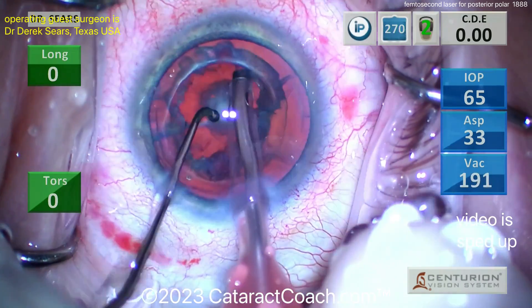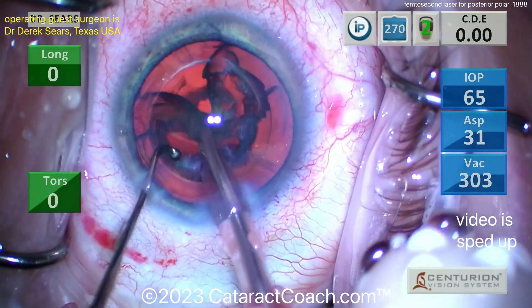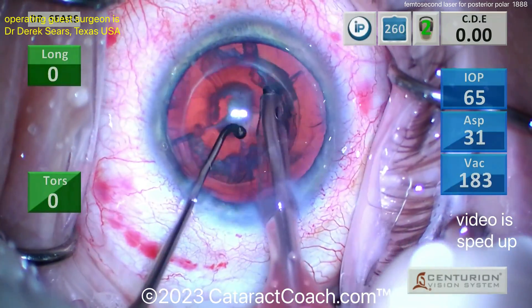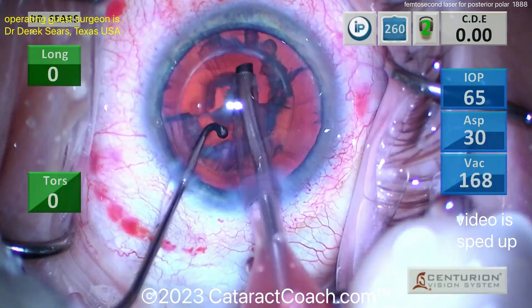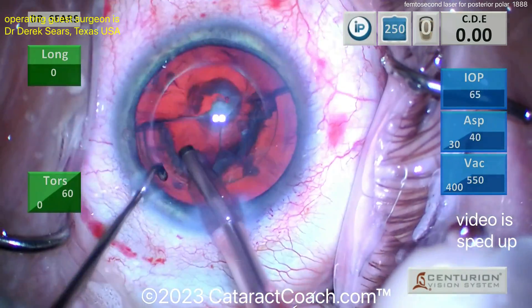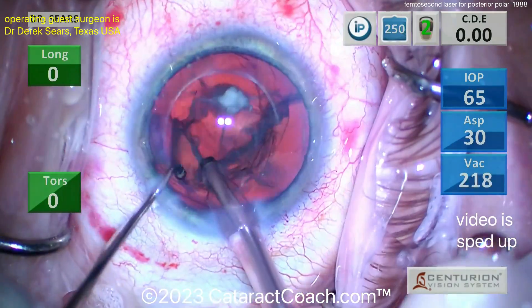I tend to do a visco dissection of the epinuclear shell, but let's see — very very good control. There you go, there's a piece of the epinuclear shell. It's not going to rotate much, so you're going to have to bring it out of the bag without much rotation, being cautious.